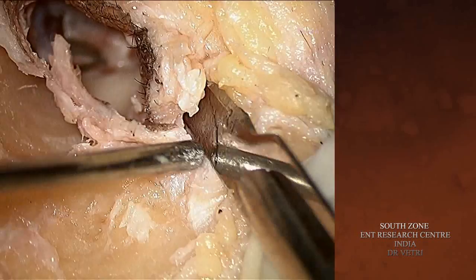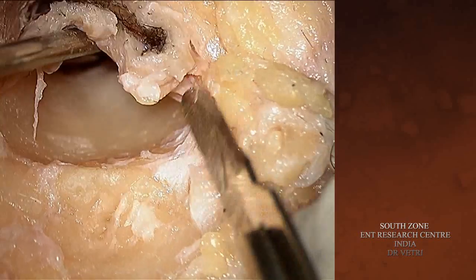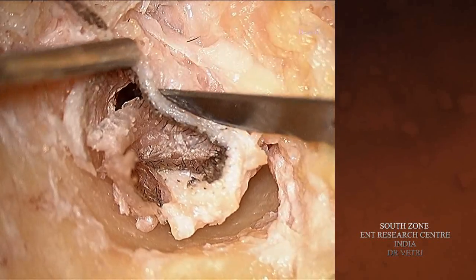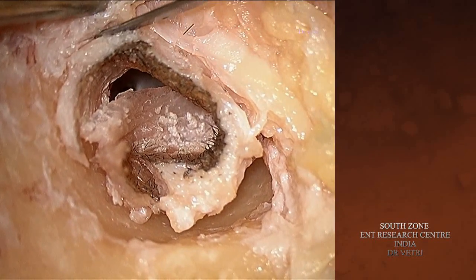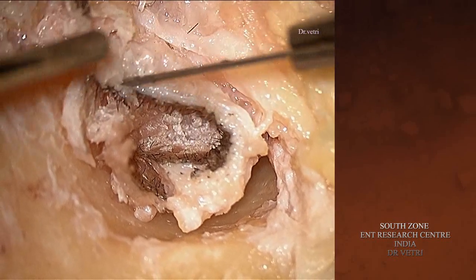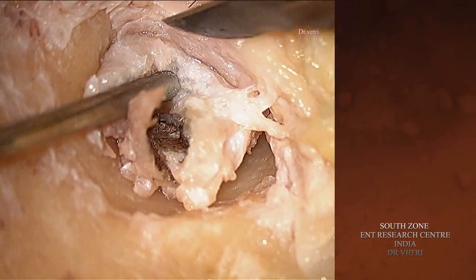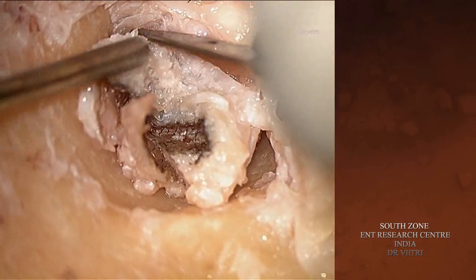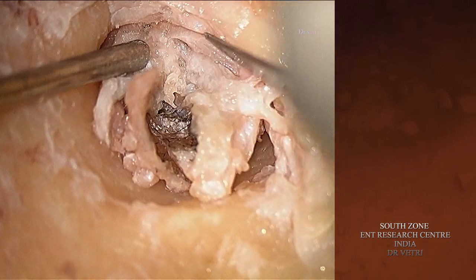The periosteum of the mastoid cortex has already been removed. Now the superior canal wall skin incision is given. Now the anterior canal wall skin incision is further deepened. The skin is very thin in the anterior part of the canal. The final incision is completed.